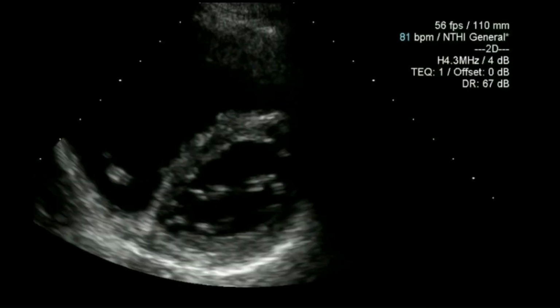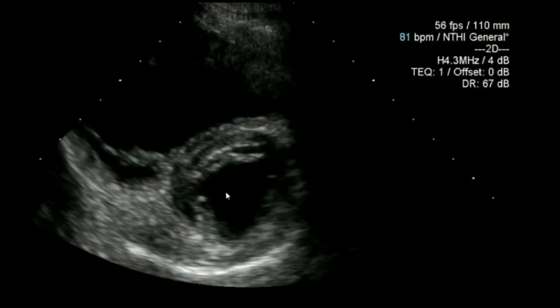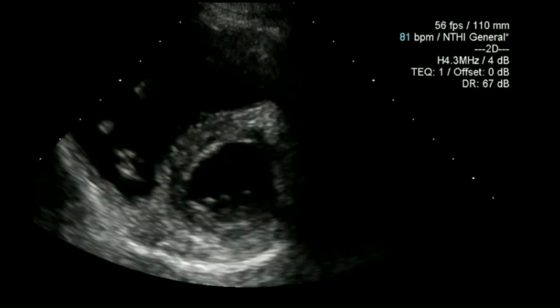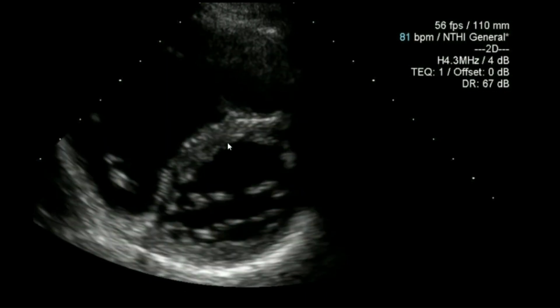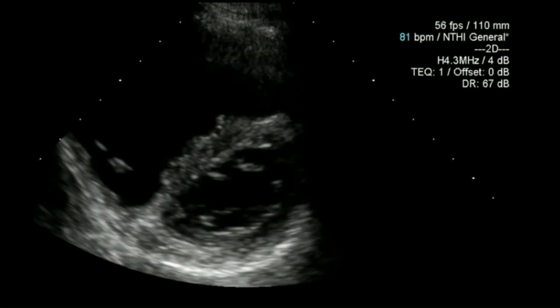As we look at the short axis view, go back there for a moment, we can see some D-shaped septal flattening in diastole. And so as I just slow that down, you can see as the cavity goes out, there's just a relative degree of flattening going there, consistent with RV volume overload.